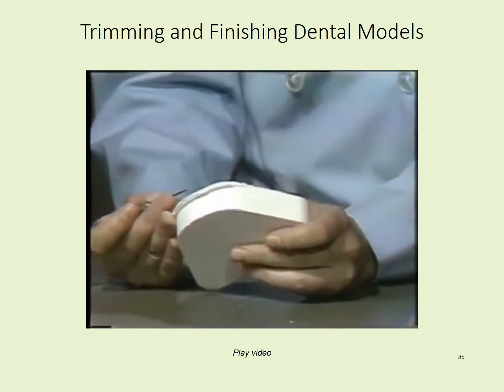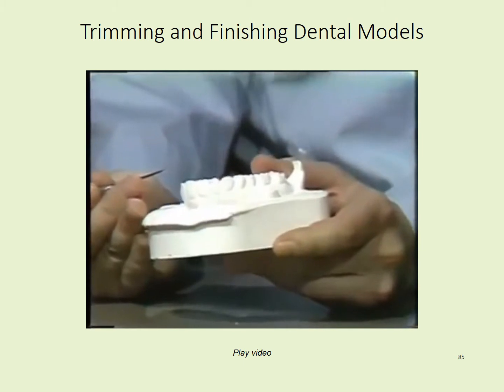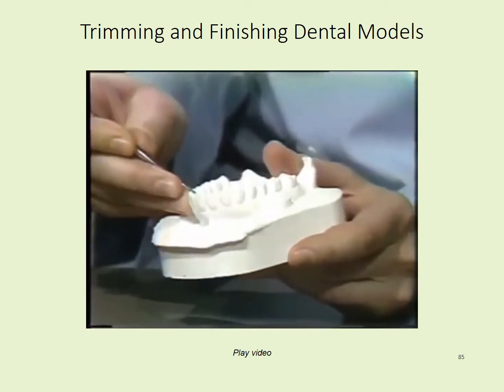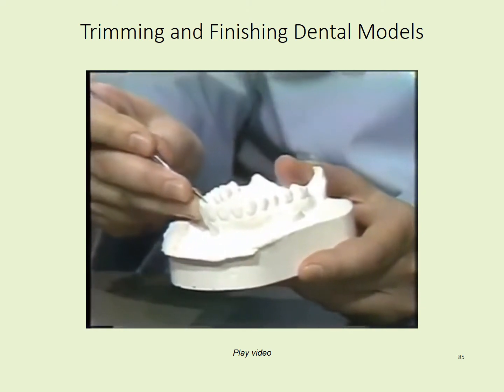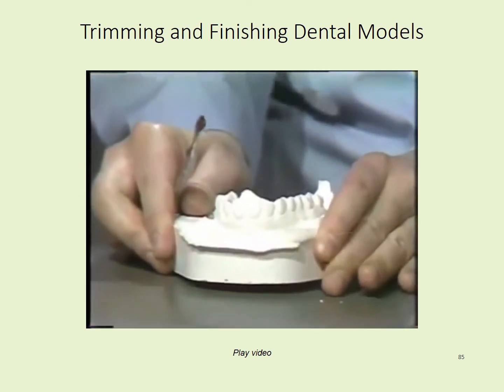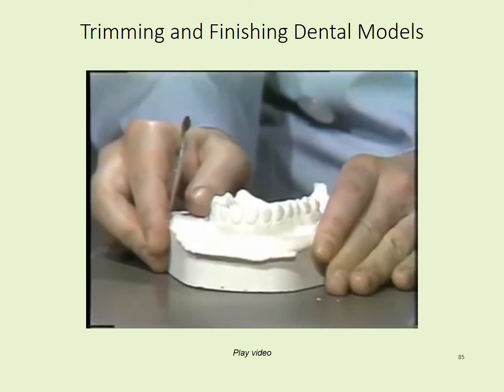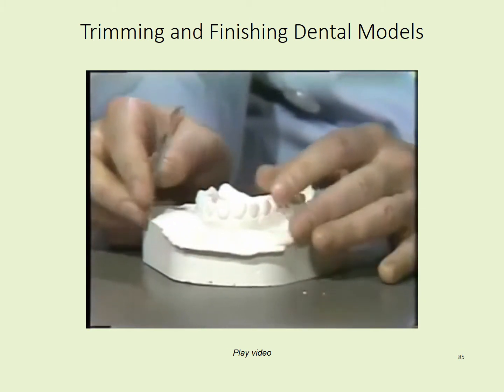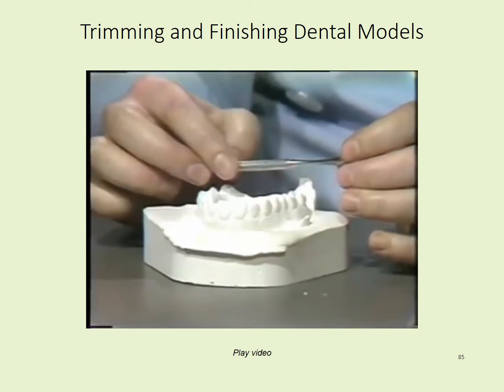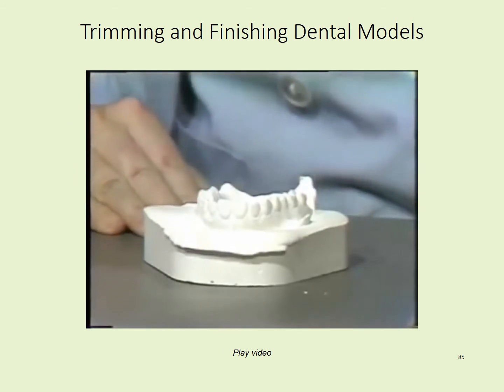Start with an adequately poured cast that is sharp and smooth and thick enough for total height. Small bubbles can be removed with a No. 7 spatula prior to trimming. If you soak the casts in water for 5 to 15 minutes, they will be easier to trim. However, make sure that you don't place them under running water or soak them for a prolonged period of time. This will cause a great deal of surface roughness. Now we'll move to the model trimmer, and I'll show you how to actually trim your models.